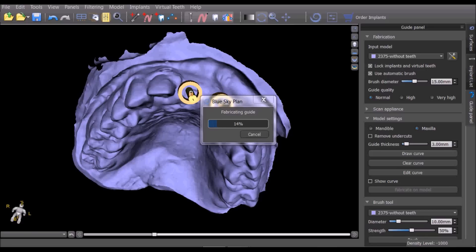The surgical guide will only be created using the software guide tubes visible in the 3D view when the surgical guide fabrication process is initialized.